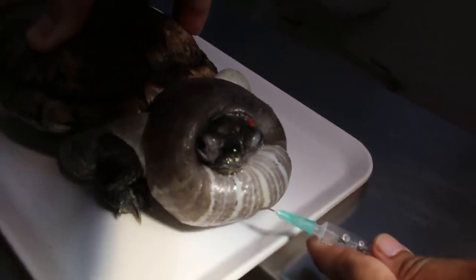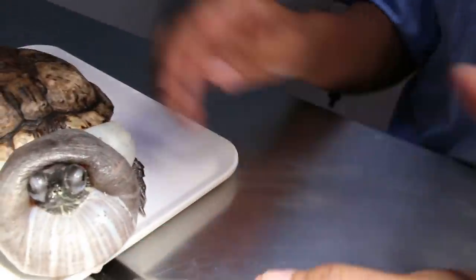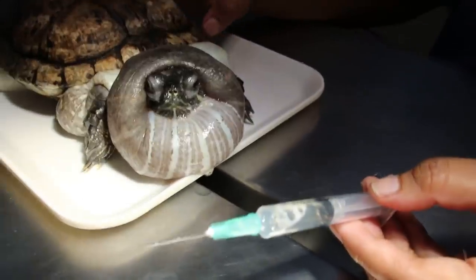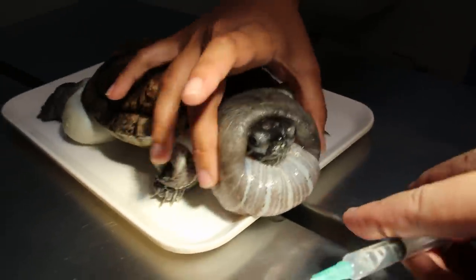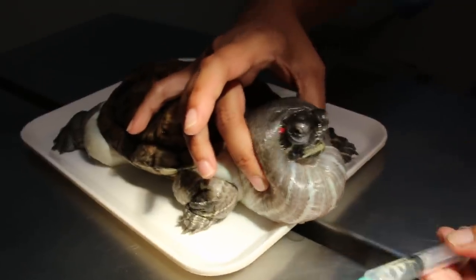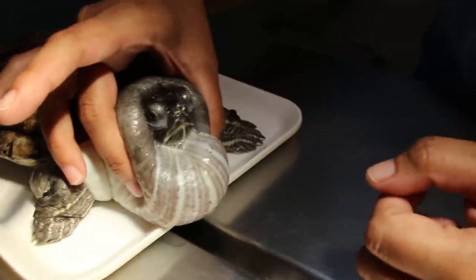Take out — there's fluid. See, the fluid is there, now let it come out. See it's coming out. You need to get it at the ventral. You can press it out now — press it out there. Cover the cap, place the cap.